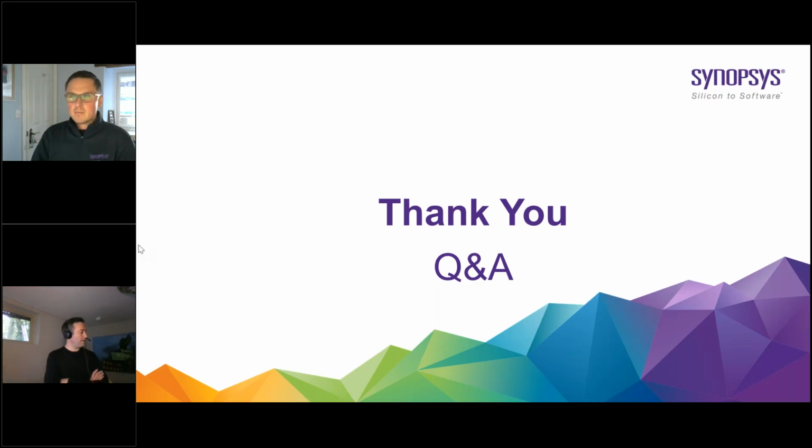Yeah. The way we like to position our off-the-shelf tools is they're segmentation aids. We're definitely not saying, oh, this is the easy button, you click this and everything's done. It's like running a threshold. You wouldn't just do a threshold and assume that that's correct. You do need to inspect it and make sure it's correct, because there is no CAD geometry from the patient from which to compare to. So it all depends on an expert review of the data.